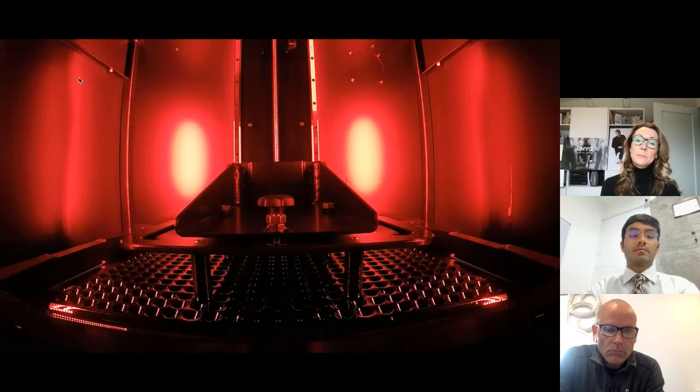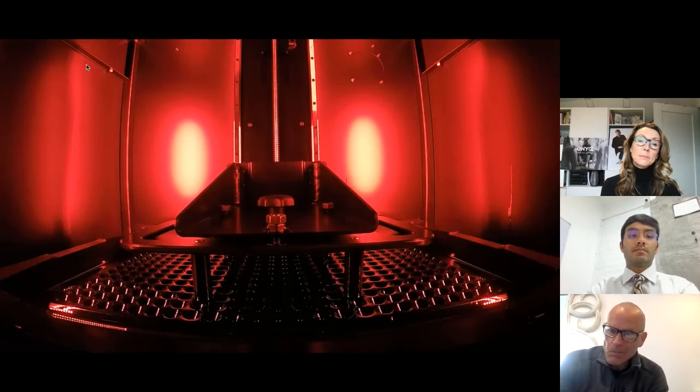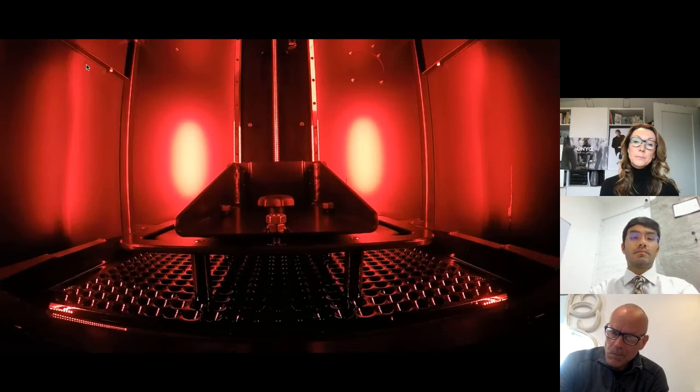So we realized that for us, 3D printing was not our ideal process, because 3D printing was created to make little production, to substitute some injection molding. So our idea was to create one immobilization as fast as possible, as cheap as possible. And that was something that none of the companies was able to give us, because including HP, the product price per unit was around $60. And in terms of orthotics, this is not viable, because this has to be a solution for everybody.